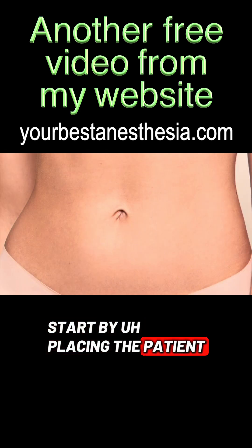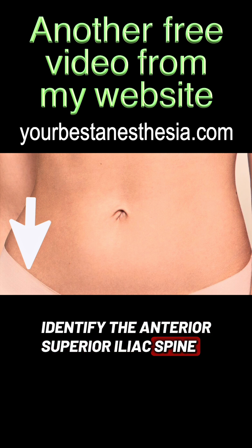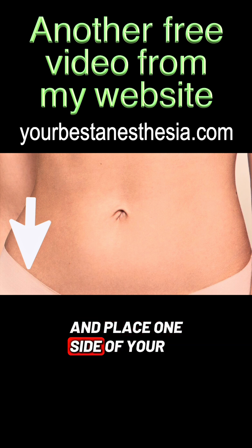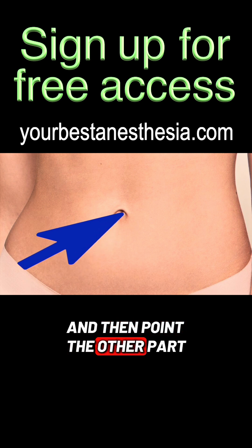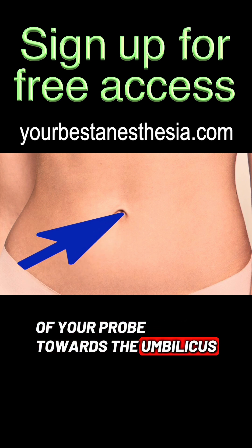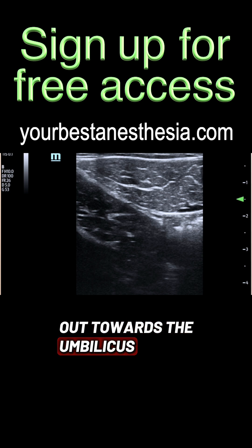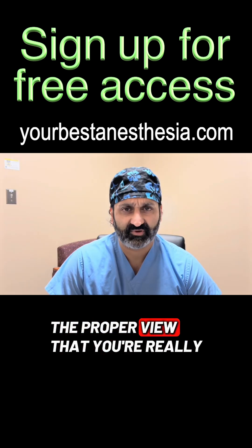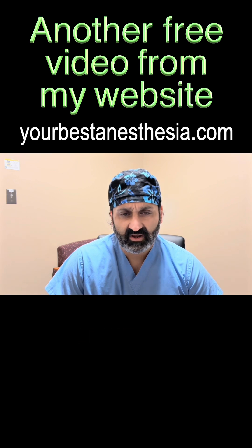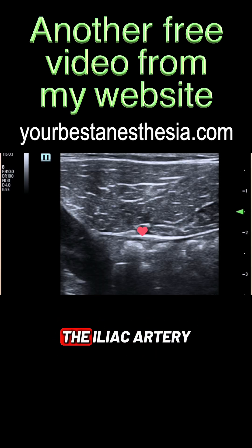Start by placing the patient supine and identify the anterior superior iliac spine, and place one side of your probe on it. Then point the other part of your probe towards the umbilicus and start slowly moving your ultrasound out towards the umbilicus. You may have to move it a little bit cephalad or caudad in order to get the proper view that you're really looking for. You'll identify an artery — this is one branch of the iliac artery.